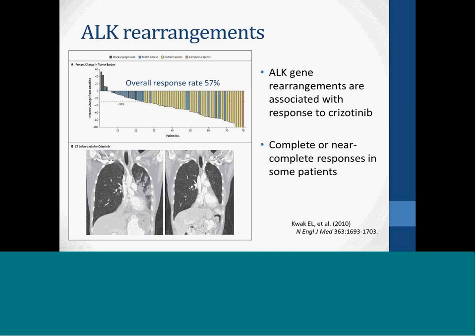And at the bottom here, you can see a coronal view of CT scans. Before crizotinib, a really significant tumor on the right here. And then after treatment, that tumor is almost completely gone.